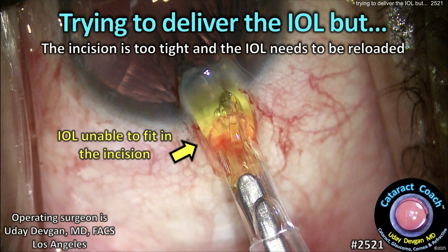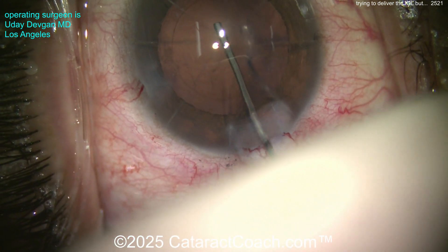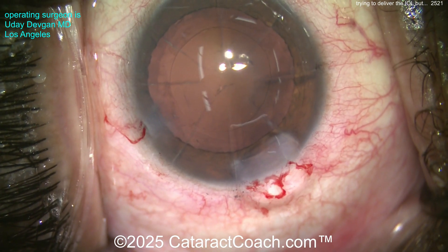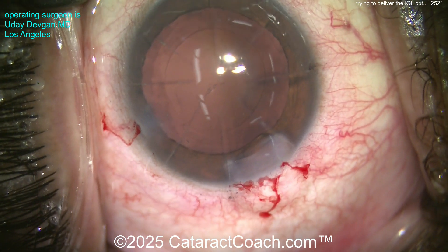At cataractcoach.com, we're trying to deliver the IOL but the incision is too tight and the eye well needs to be reloaded. Here I'm operating — look at the case. What do you notice in the cornea? Radial keratotomy cuts — eight of them. You can see I've put my incisions between the RK cuts; I don't want to intersect them. We've also hit those limbal vessels, so you know it's going to seal well.